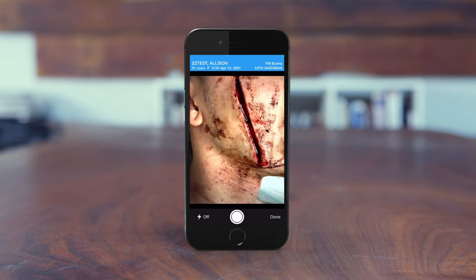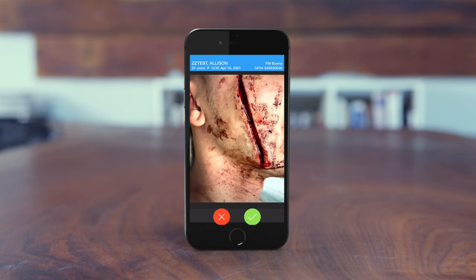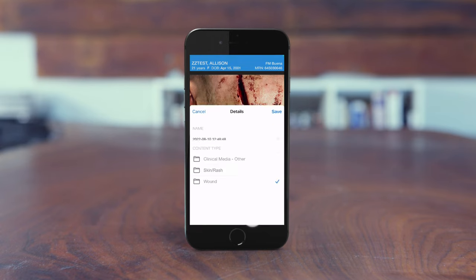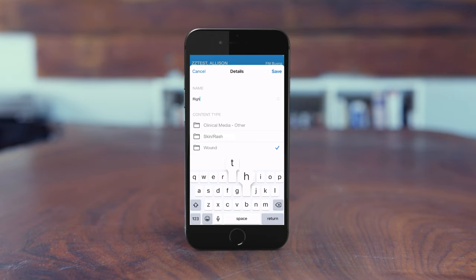Tap the white circle or camera icon to take a picture. The captured image displays for confirmation. Take note of the patient's information at the top and ensure you've got the correct patient before proceeding, then tap the green circle to continue. You're presented with a list of content types — make an appropriate selection. Change the name at the top to indicate the body part for easier identification in the chart.